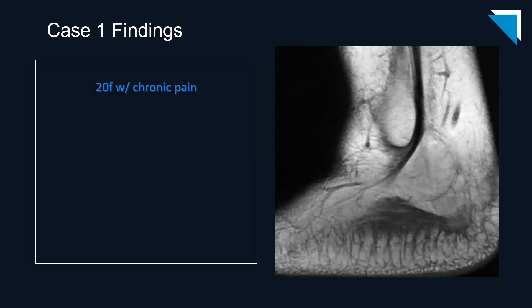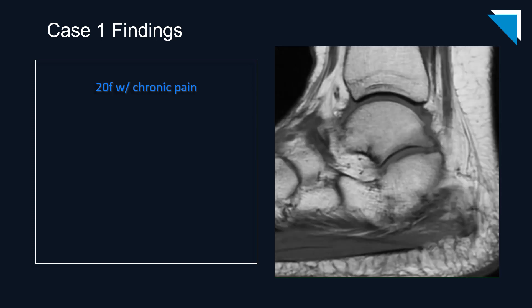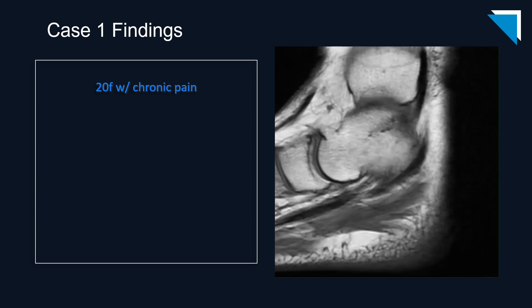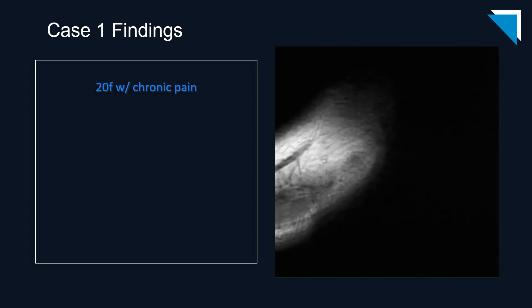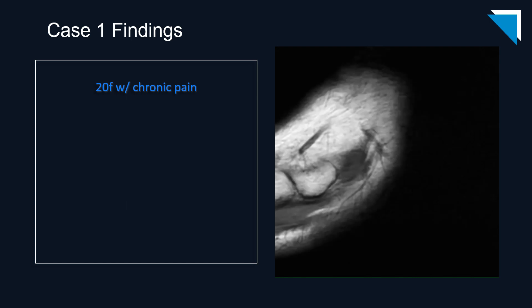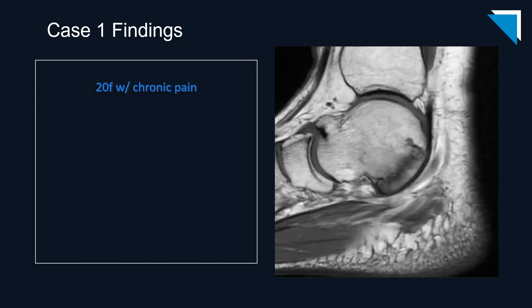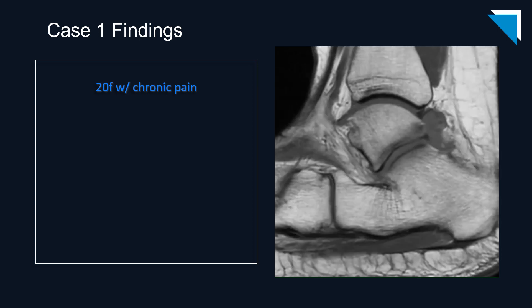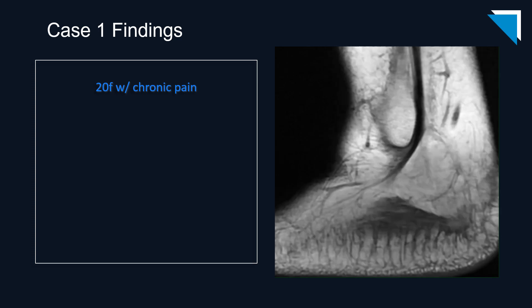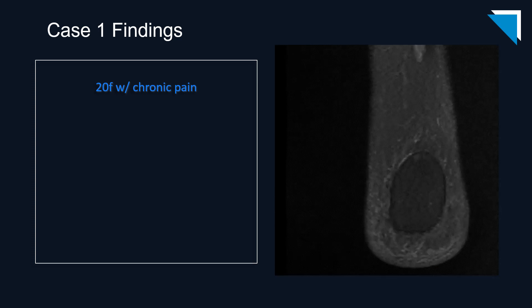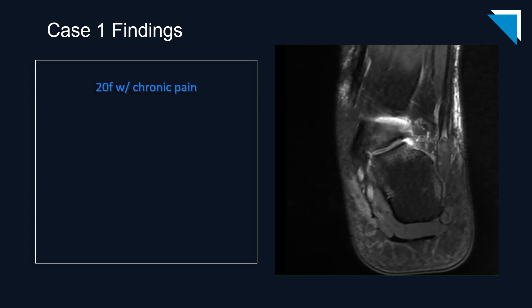Here are the corresponding images from the non-fat saturated T1-weighted sequence. Remember, these are good images for fractures and for the T1 hypointensity that is characteristic of acute osteomyelitis. And here is the coronal fluid-sensitive sequence.